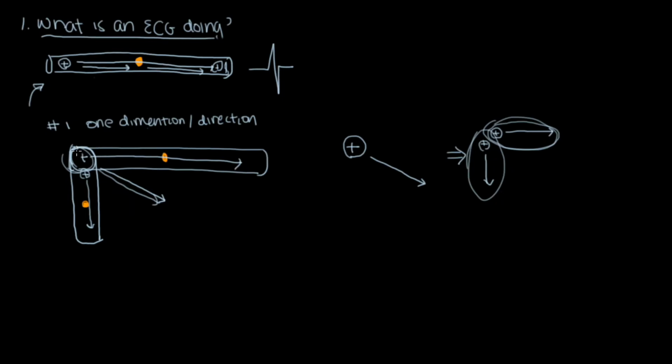And of course, the most convenient way to record this is if you were to have, say, a diagonal tube like this with a sensor. It can capture the movement of the charge without having to do any other fancy math or interpretation. But what I want you to know is that, for example, this one may look kind of like this. This one also looks like a smaller charge like this. Whereas this one will look like a larger charge going right along it, so it's going to look kind of like that. It's even larger. So that's caveat number one.